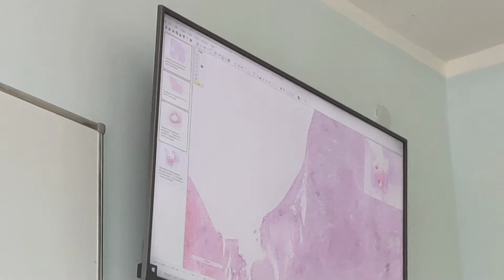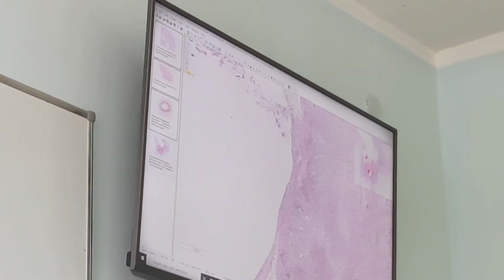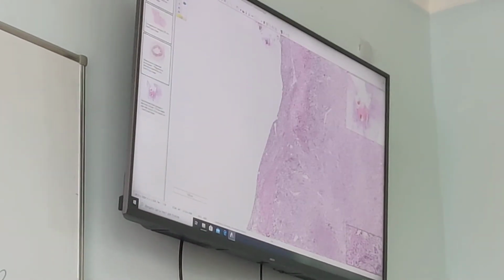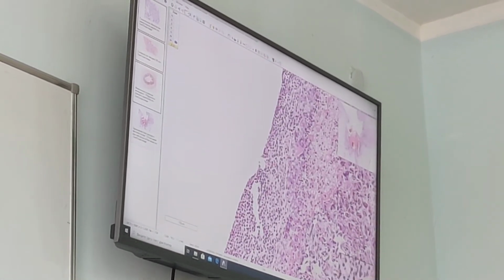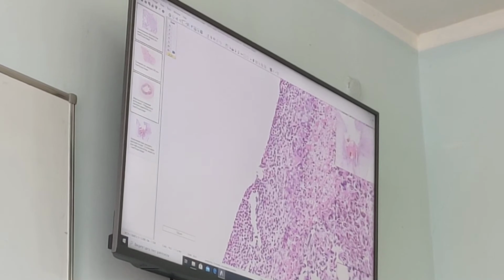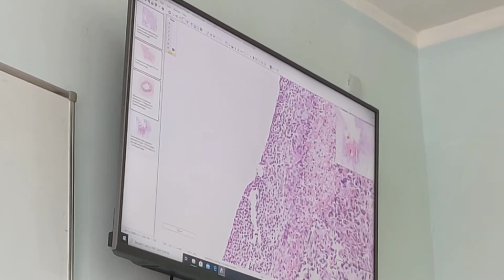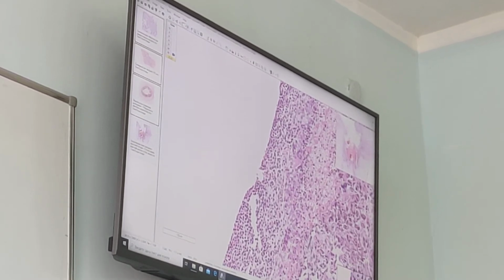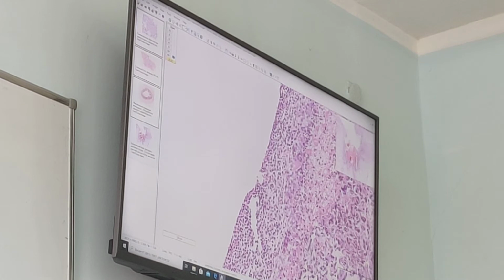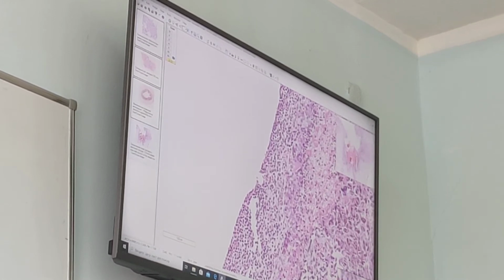You know that in the period of exacerbation, the wall of the ulcer consists of 4 layers. Let's see in detail about these layers. Superficial layer with multiple neutrophils. This is fibrinous purulent exudate. We can see small fibrin threads, pinkish in color, and we can see a lot of neutrophils here. Fibrinous purulent exudate, first layer.